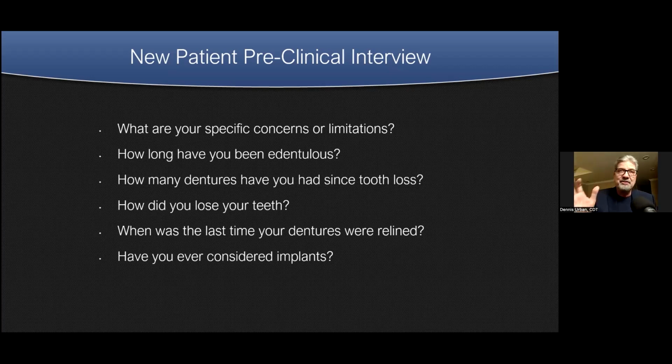I hear so many stories about patients getting a new denture and never even coming back to the dental office to get things checked out. Well, things change, whether it be occlusion or recession. So it's important that the patient goes back to the dental office. And have you ever considered implants? Patients who have a lot of problems with removables should consider implants if they're able to get them.